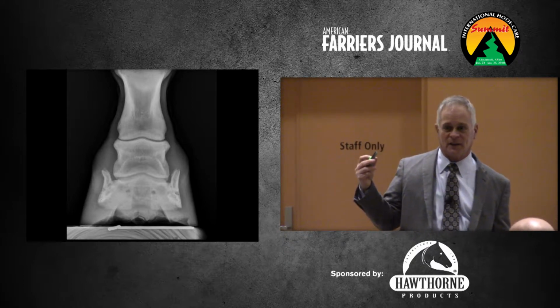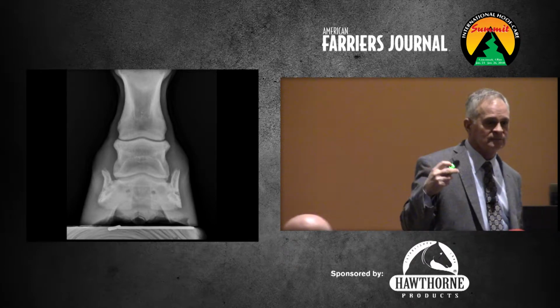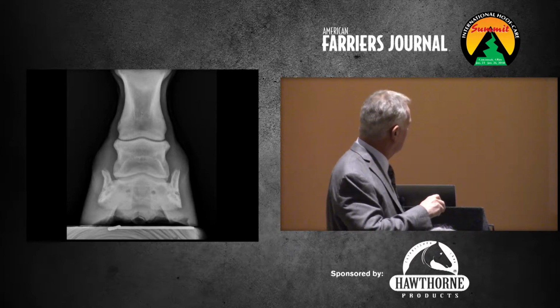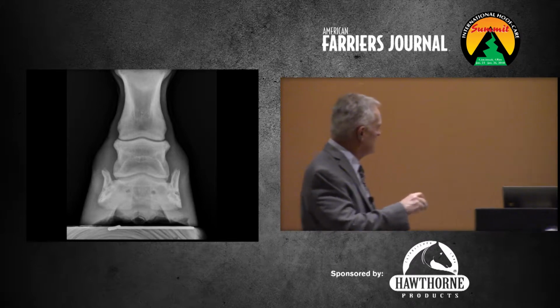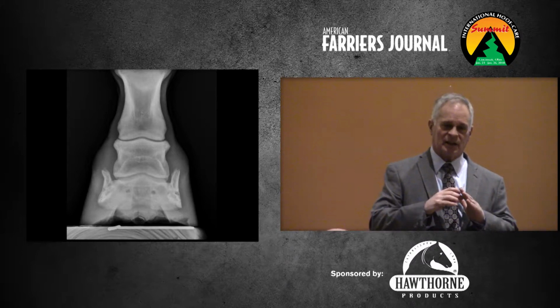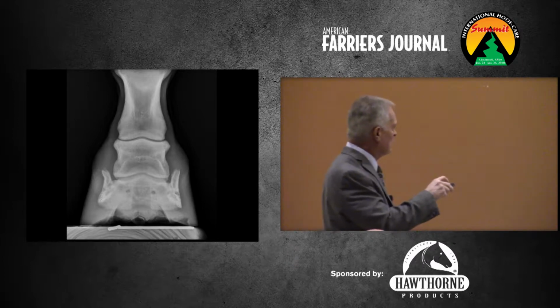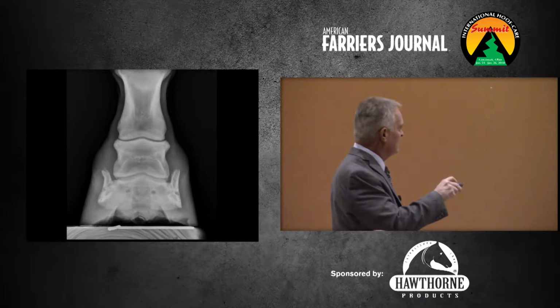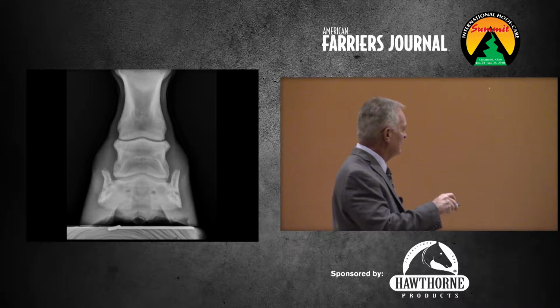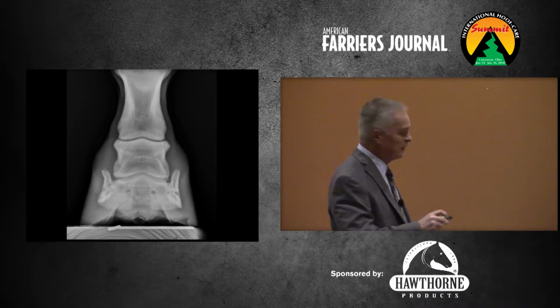Okay, so here a keratoma. So why a keratoma? See this thing right here, that lucency? And when we say lucent, I encourage you to try to learn. That means a lack of density. So in a radiograph, the bone, because it's dense, shows up white. So we'd call lucent that blacker area. So something there, what is that? Take another view and there you go.